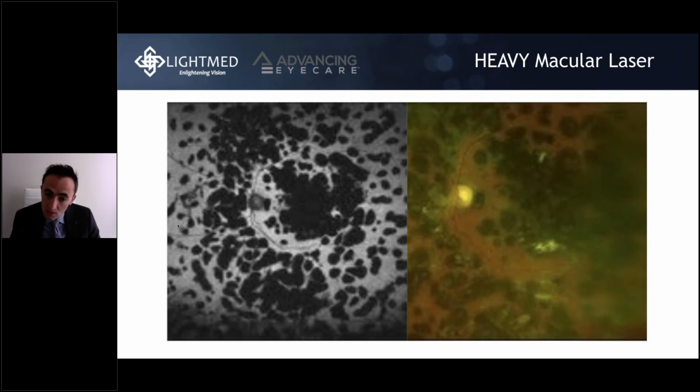And still, I start making my way slowly towards the center part of the macula. So if I start on the arcade with the focal laser, then I go to the SP mode, I start applying it perifoveally. And once I see that the treatment is all good, then I can target my treatment towards the central part of the macula. And once I know that the settings that I chose were safe for this patient, I have recently been switching also to the pattern scan, where I do 2x2 or 3x3 spots at the same time, because that will make my treatment much faster. And I usually finish these treatments within a minute or two maximum.